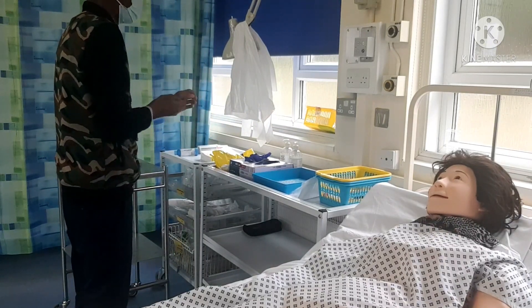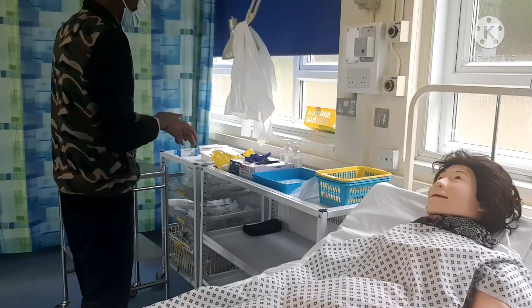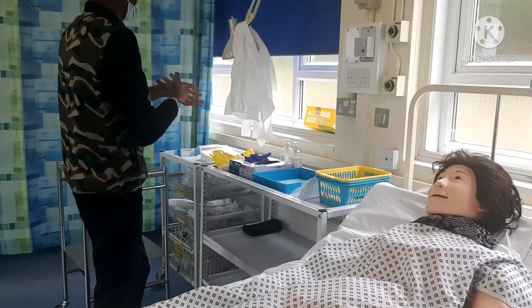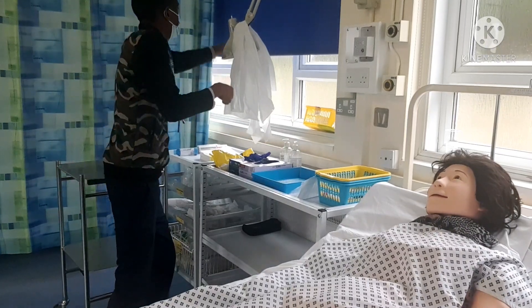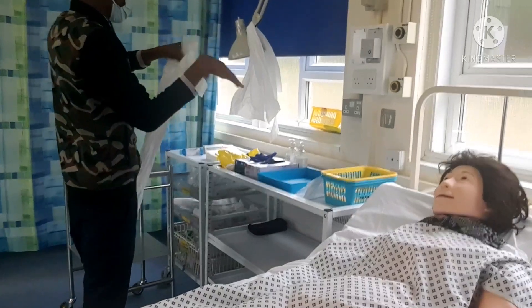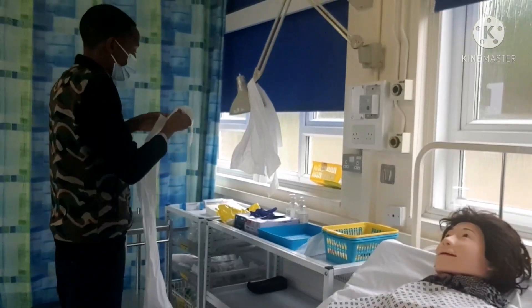Mr. Sosa, the aprons are good to go. Your tray was washed in the last 24 hours with soap and water. I'll prepare my patient a little bit and get my toilet paper as well.